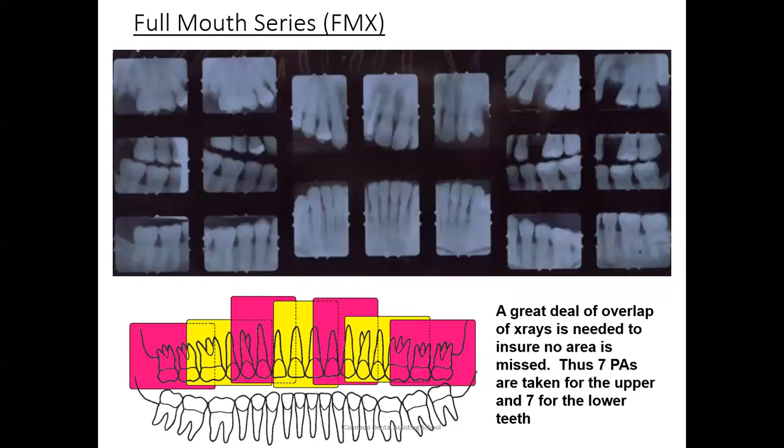Because if you take a good look, you can capture anywhere from 3 to 4 teeth in an x-ray at a time. So please don't waste time on retakes, and remember that a lot of these will overlap, and that's good. We want that to happen because we can see different angles in our proximal space and also the periapicals at a different angle in each film.